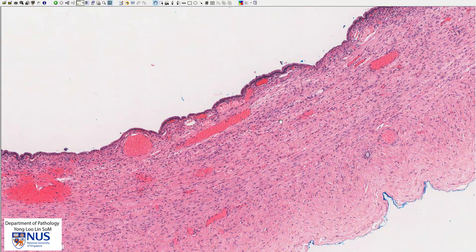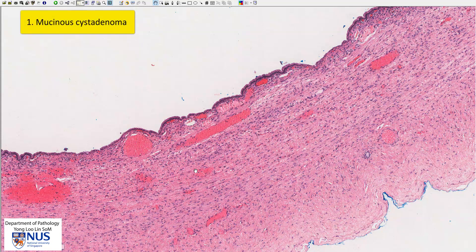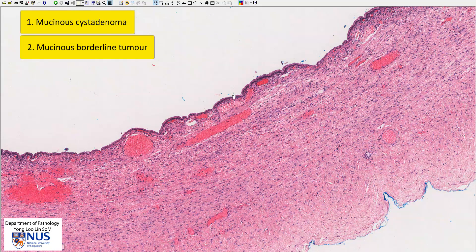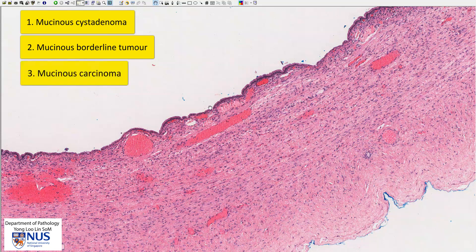Mucinous cystadenoma is a benign tumor. Among these tumors, there is a spectrum of the degree of proliferation as well as aggressiveness of behavior, ranging from benign to malignant. There is the mucinous cystadenoma, which is benign; then the mucinous borderline tumor, which shows more complexity, papillary architecture, and some degree of nuclear stratification; and there is mucinous carcinoma, which shows invasion.